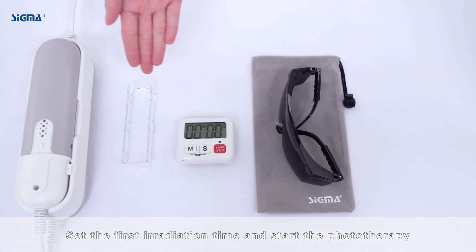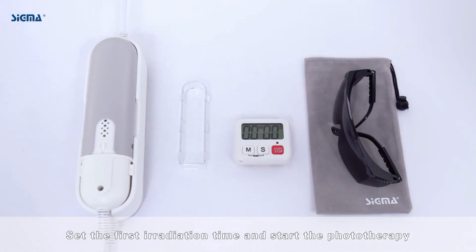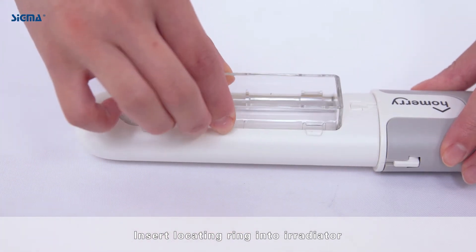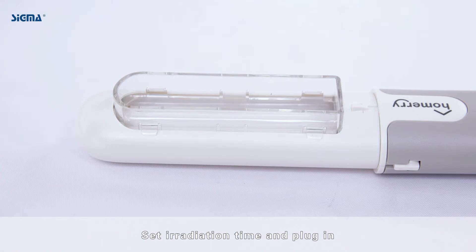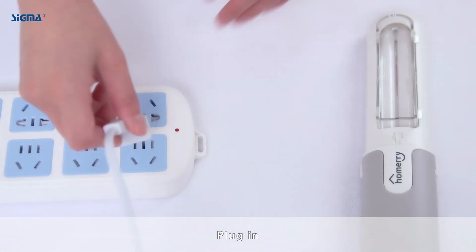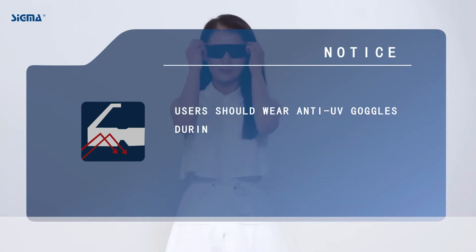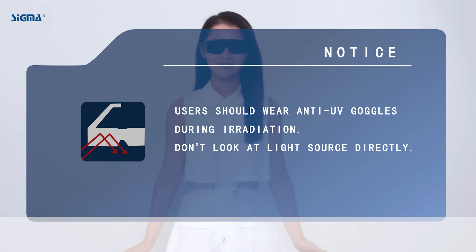Set the first irradiation time and start the phototherapy. Insert the locating ring, set irradiation time, and plug in. Notice: users should wear anti-UV goggles during irradiation. Do not look at the light source directly.